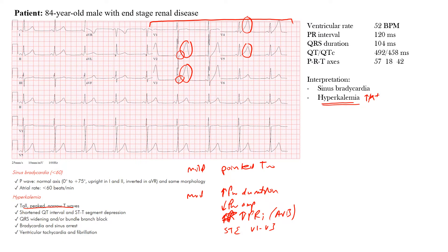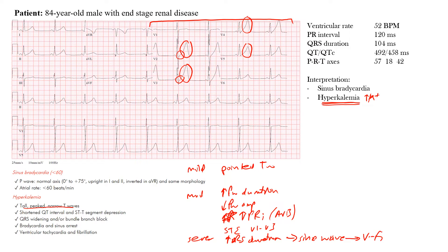We don't see ST elevation here — the main thing we're going for is hyperkalemia. In severe hyperkalemia, you may also see an increase in the QRS duration, where the width widens. From there you can get a sine wave pattern, and then from the sine wave you can progress to ventricular fibrillation, or V-fib.